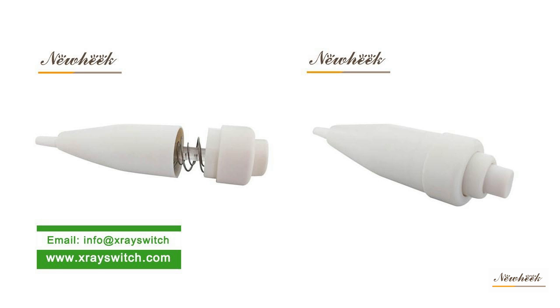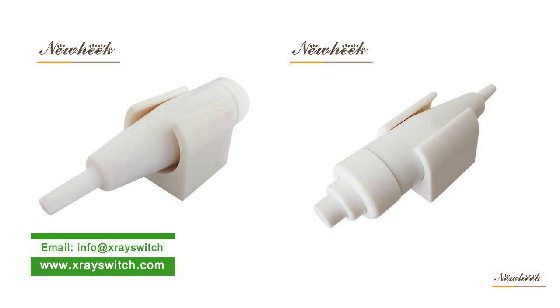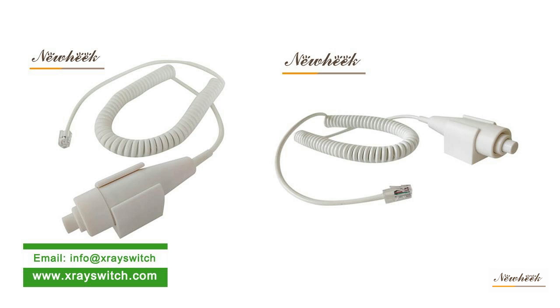The X-ray hand switch is an important part of the X-ray machine. The wired X-ray hand switch allows the medical X-ray machine to prepare and expose by manually pressing down the gear. Usually the medical X-ray machine has two gears: first and second gears.